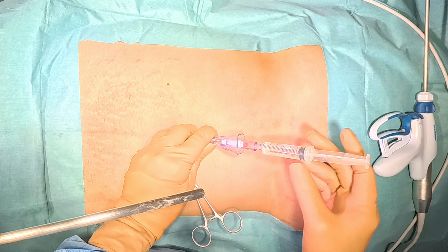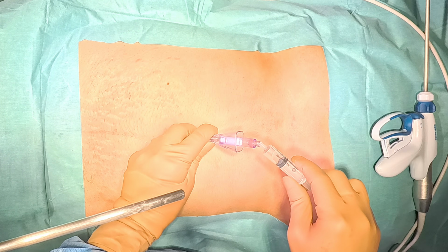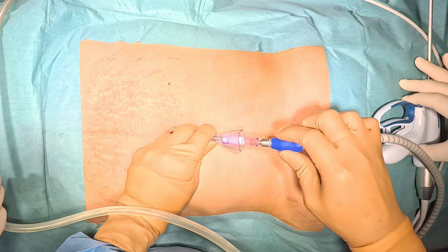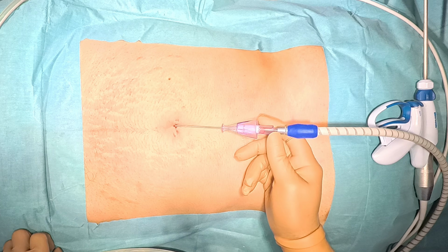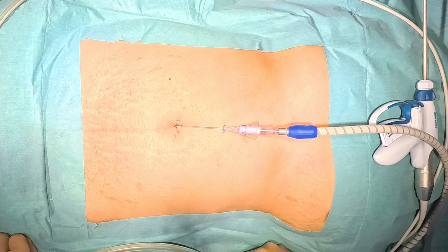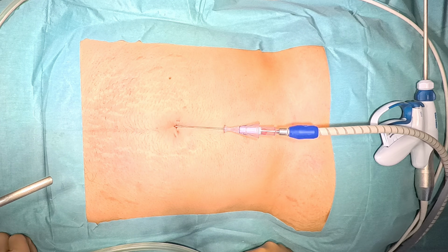Now this is the syringe, and this is the irrigation test, suction test and then hanging drop test. Then we will start the insufflation. Pressure is kept at 15 and slowly we will wait for the pneumoperitoneum to increase so that the actual pressure becomes equal to the preset pressure.